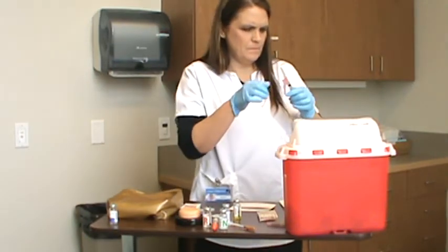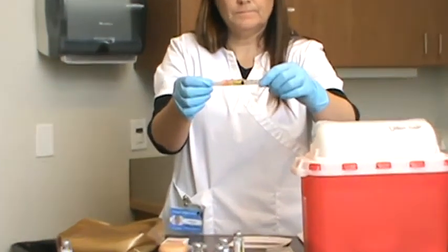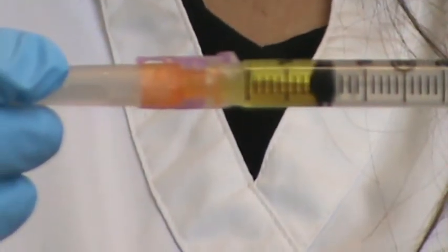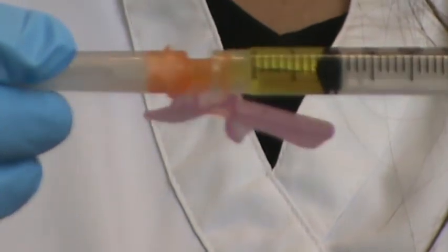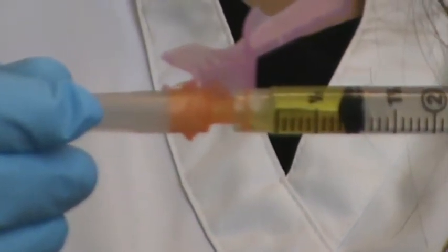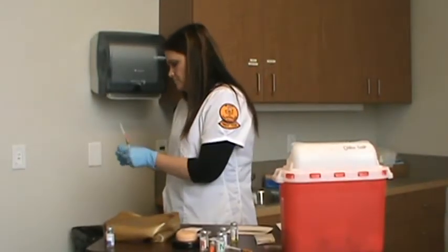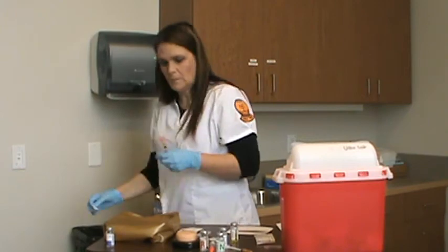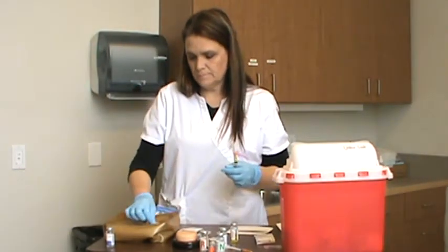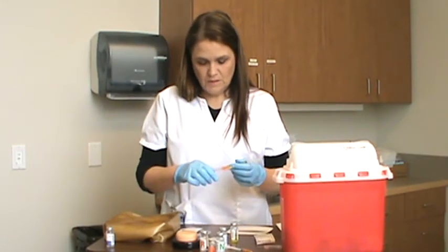Okay, here's my 0.8. This one, other way, a little bit more. There we go, good. Okay, so wipe from the inside out, and do a Z fashion again.